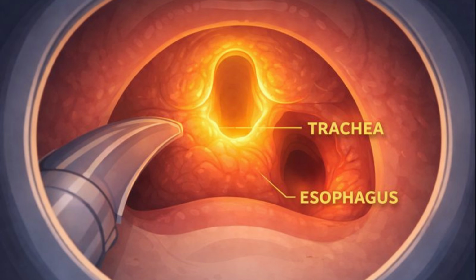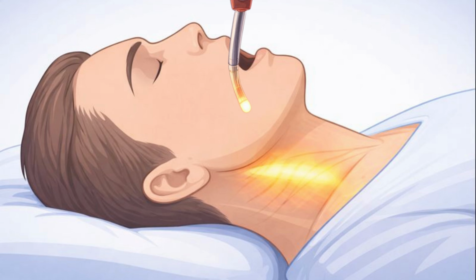This technique replaces vision with physics. Instead of seeing the airway, you interpret light. If you understand anatomy and respect the glow, the airway reveals itself. This is why Lightwand intubation becomes priceless when nothing else works.